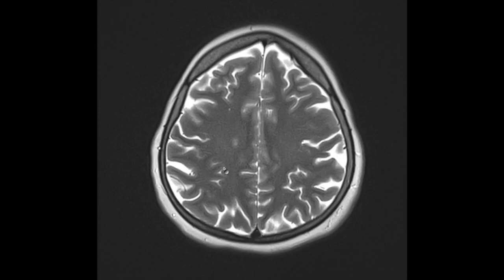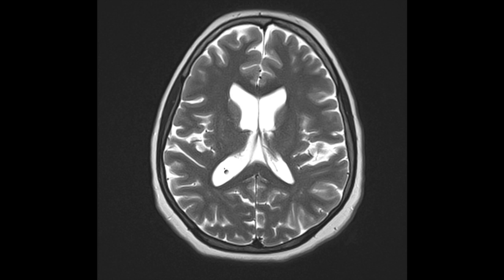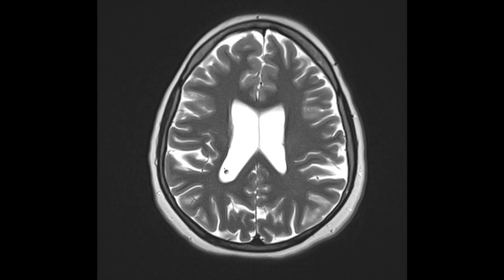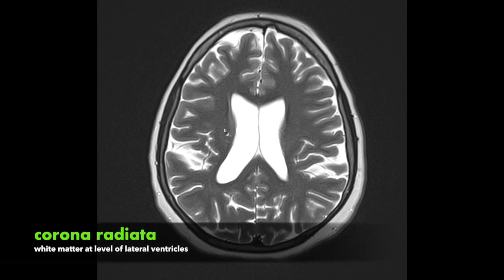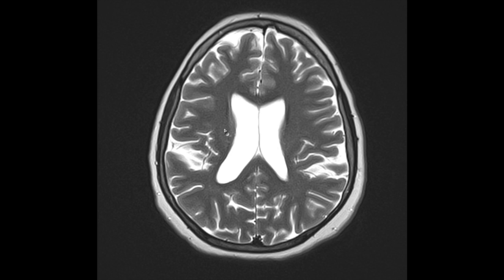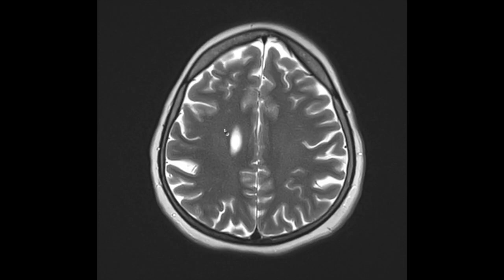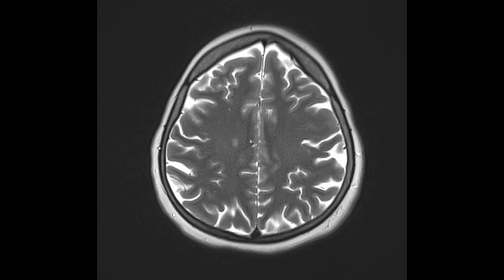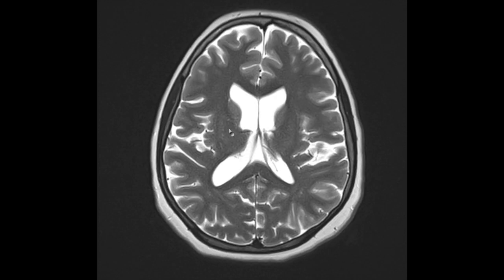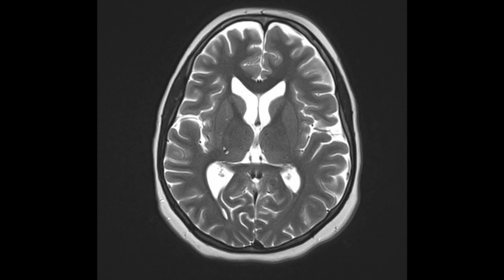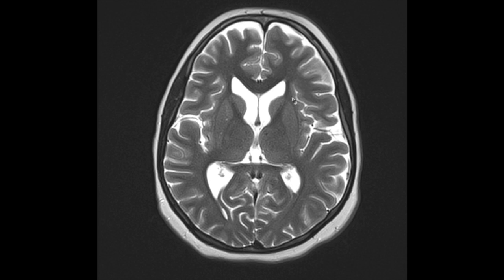Coming further down to the level of the lateral ventricles, at this level you have the deep white matter known as the corona radiata. If you go more dorsal to that you see the centrum semiovale. Coming back down to the level of the corona radiata and going further down, you'll see that it becomes continuous with the internal capsule.